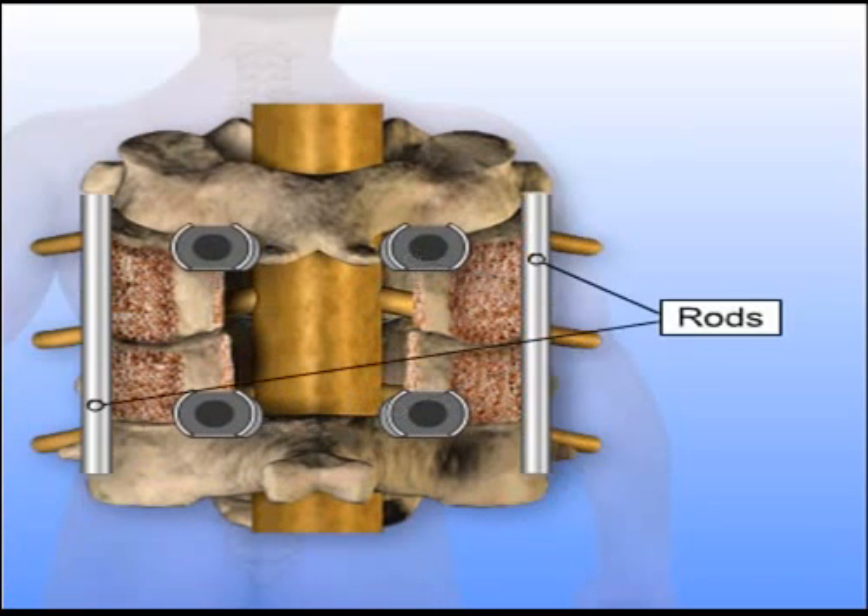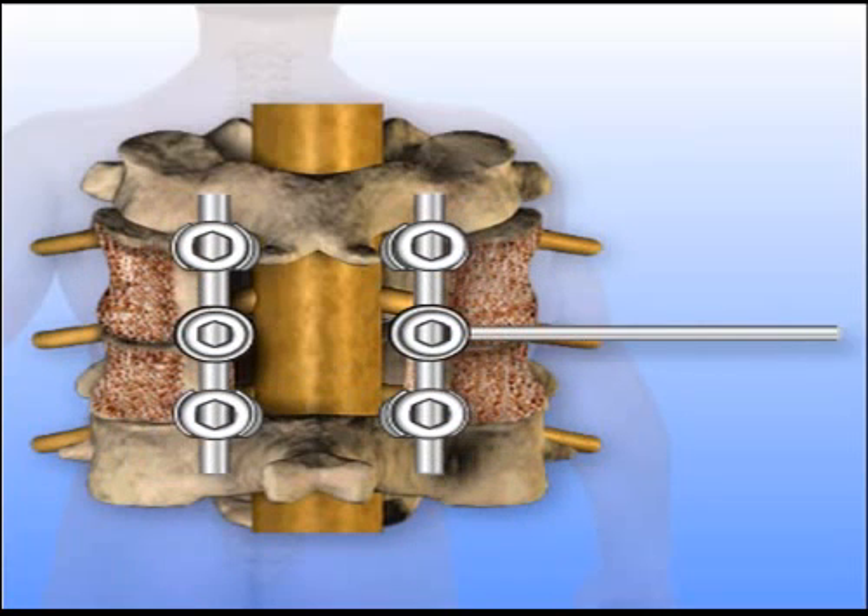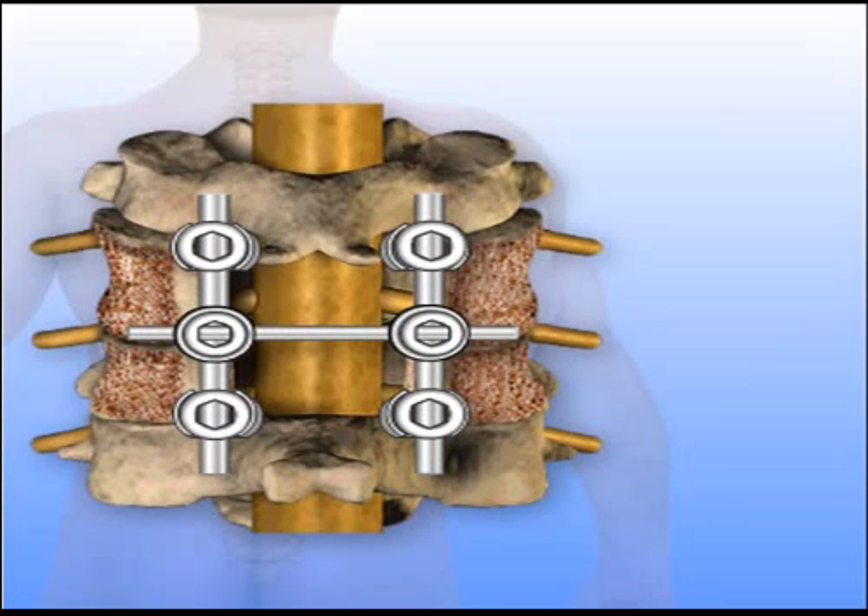Before the bone grafting is done, instrumentation is added to the vertebrae. One method involves placing metal hooks along the back of the spine. The hooks are connected by rods, which are added to provide stability to the spine and prevent the vertebrae from moving while the bone graft fusion takes place.